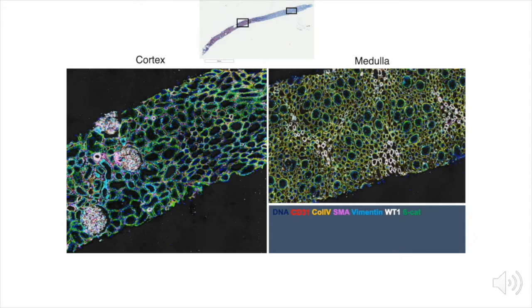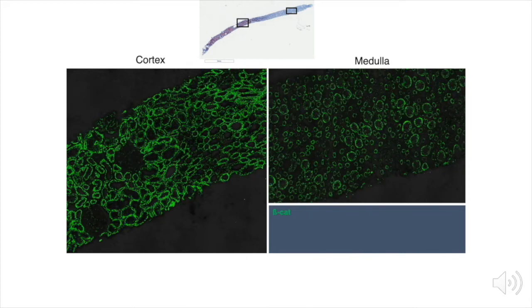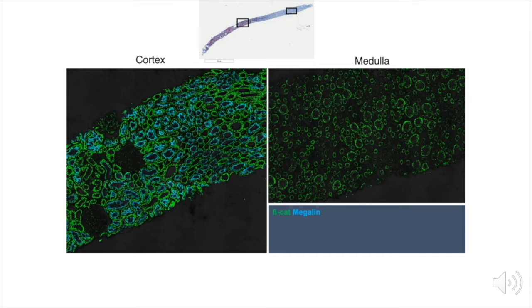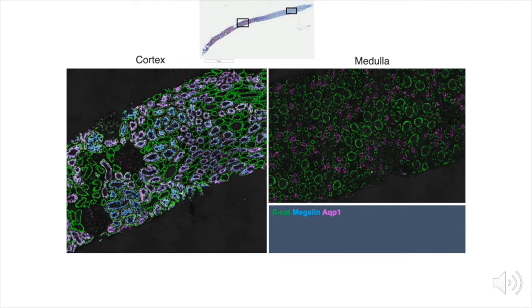Finally, I am showing beta-catenin in green, a marker of tubular epithelium. If we focus solely on the tubules, we can start using our carefully selected antibody panel to determine which tubules are proximal tubules, as marked by dual expression for megalin in cyan and aquaporin I in magenta. Note that in the medulla, aquaporin I marks the descending limb of the loop of Henle.